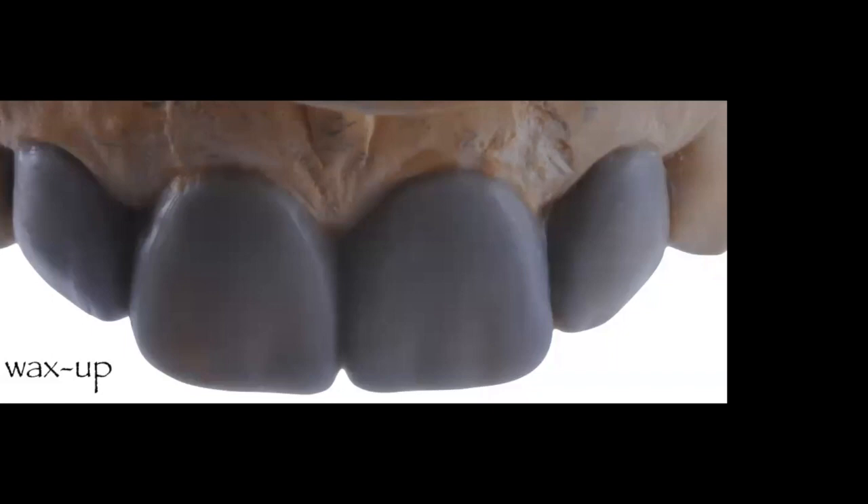If you need to reduce the stone to straighten things out, that's when your treatment plan really comes alive — you now know where you need more reduction, less reduction, or no reduction. Looking at the wax-up, areas where the stone shows through the gray wax are areas that will most likely need more reduction to achieve the final result. The prototype serves as a preparation guide, and controlling that preparation is crucial for survival rate.